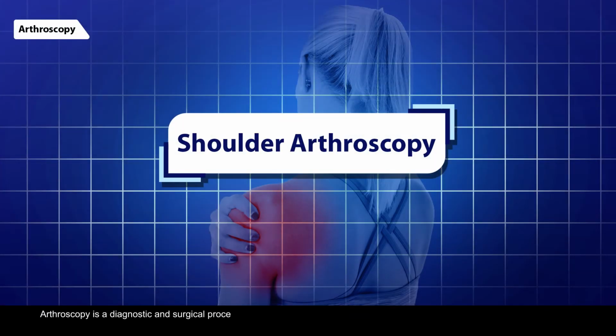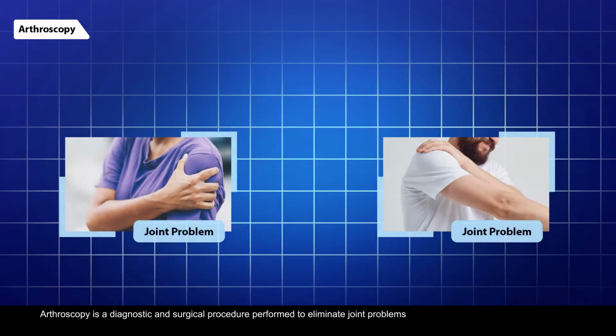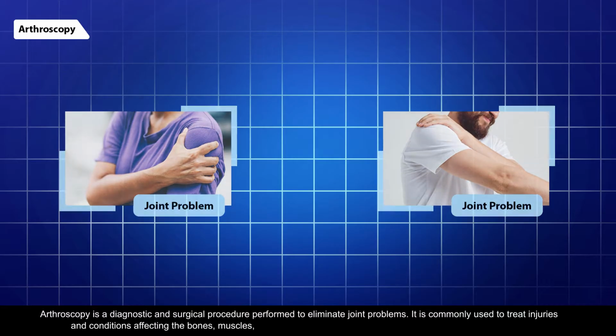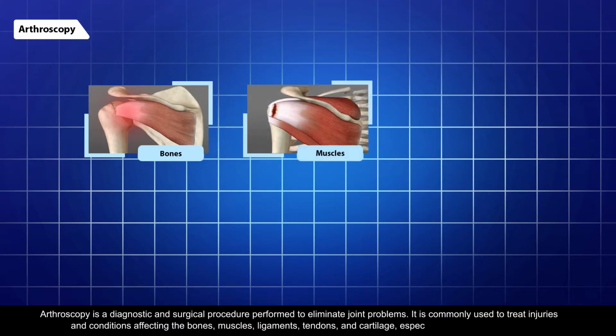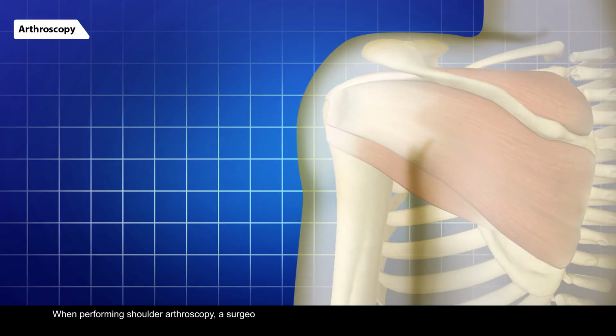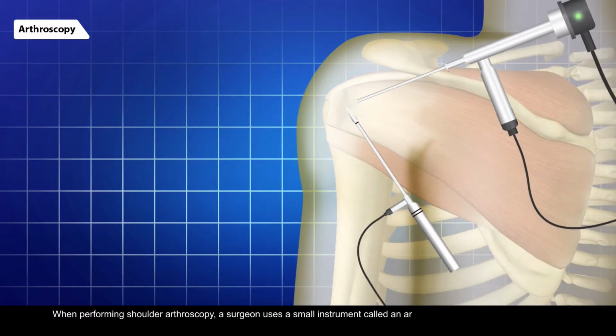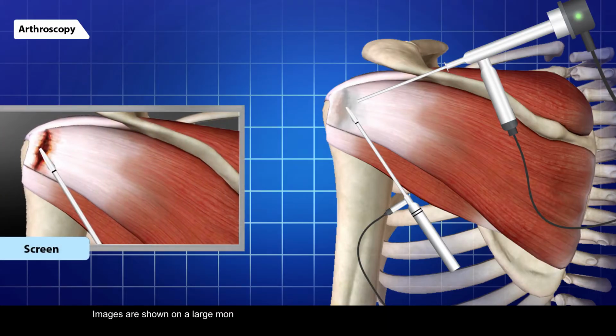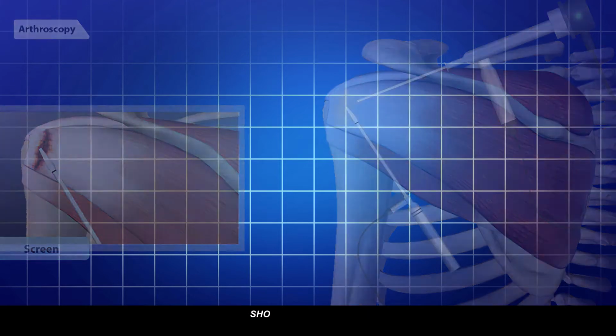Arthroscopy is a diagnostic and surgical procedure performed to eliminate joint problems. It is commonly used to treat injuries and conditions affecting the bones, muscles, ligaments, tendons, and cartilage, especially in the shoulder joint. When performing shoulder arthroscopy, a surgeon uses a small instrument called an arthroscope. This pencil-sized tool uses a camera and light system to obtain images of the damaged area. Images are shown on a large monitor where your surgeon can have a better view of the surgical site.